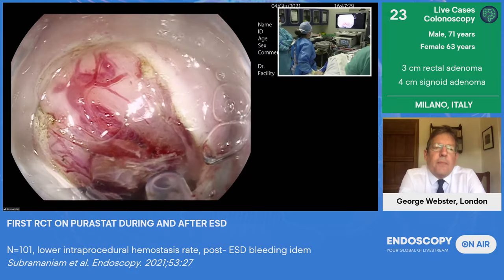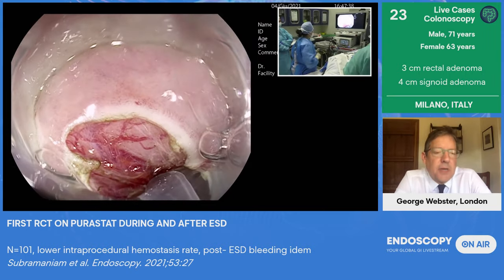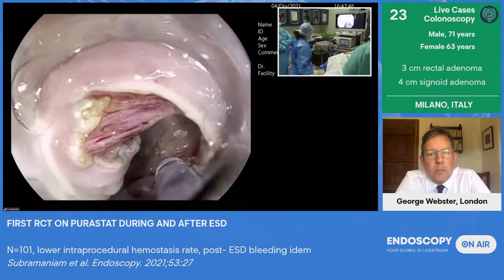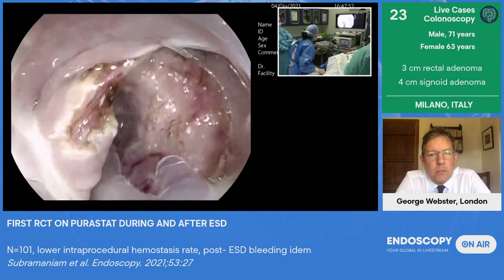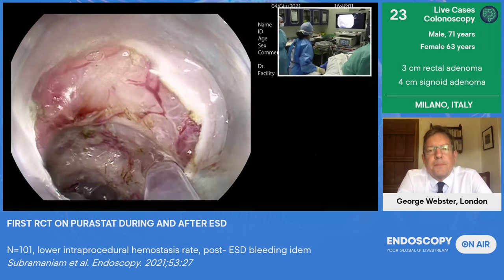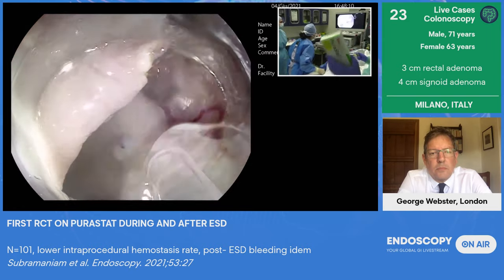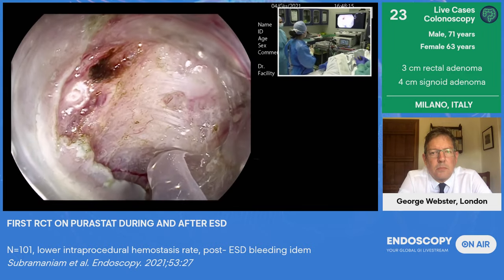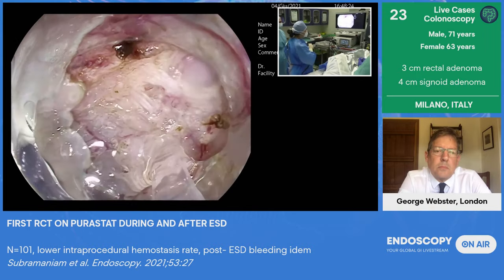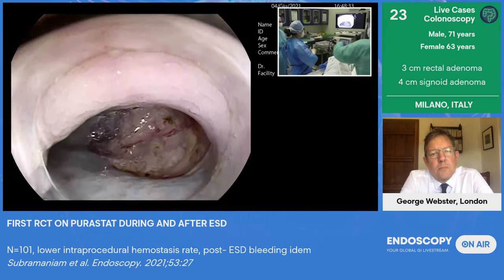And can I ask, would you consider Purastat in all ESDs or only in those where there is some concern about ongoing bleeding? Yeah, in this case, we are using it in two manners. I mean, just to help us in achieving hemostasis of those small vessels that were tiny bleeding, but also in a prophylactic way, just to prevent delayed bleeding. So it depends on the aim of what you are doing. Usually for prevention, it's very good to apply the gel that is transparent, easy to use, and ready to be used, because you have it in the fridge, it's a simple catheter. You don't need a stepwise approach to understand how to apply it. It's very, very simple. My assistant is just pushing the syringe and all the content is here. So in a few seconds you're done and your bed is covered.